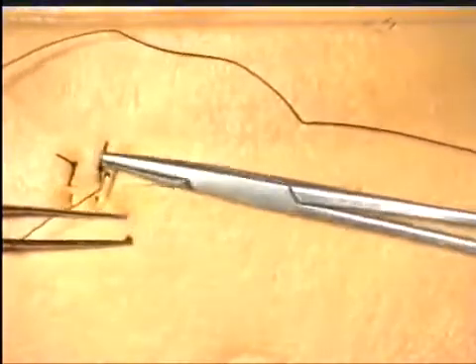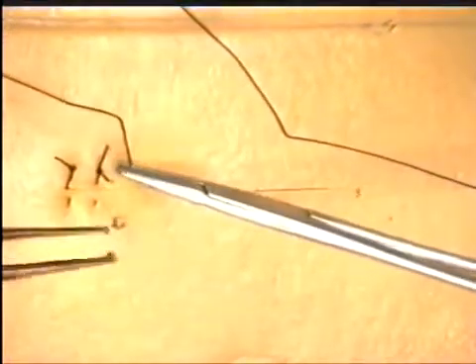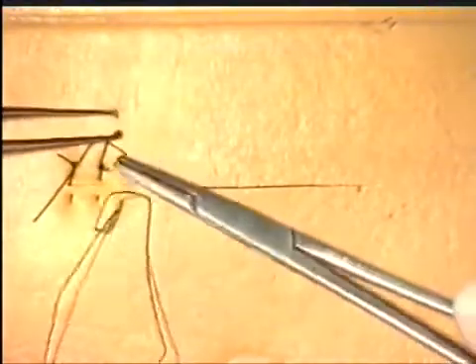Let's insert just one more vertical mattress suture in at right angles. Reverse the needle and then going back, just taking the wound edges as seen.